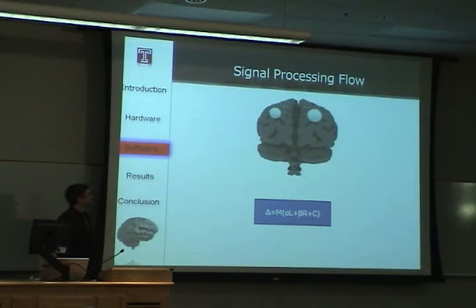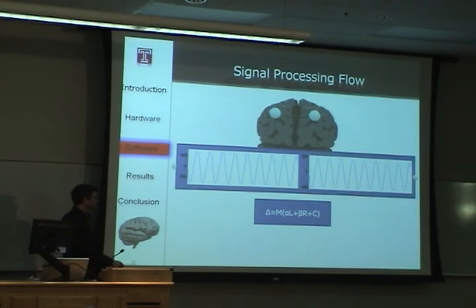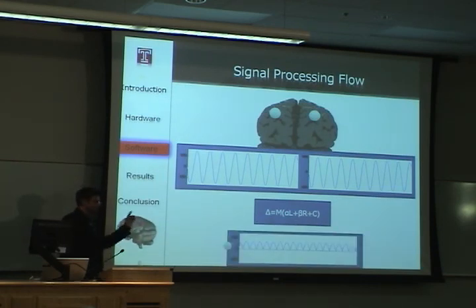And just to kind of bring it home, now we're going to increase the amplitude of the right side of the brain, which gives us the 500 on the right, and we're taking the 150 that we started with. Going back to the black box again, now we're looking at the cursor position being pushed up the screen.